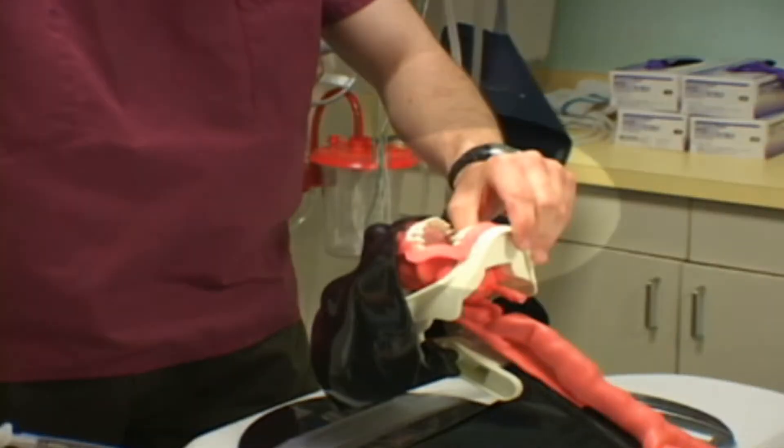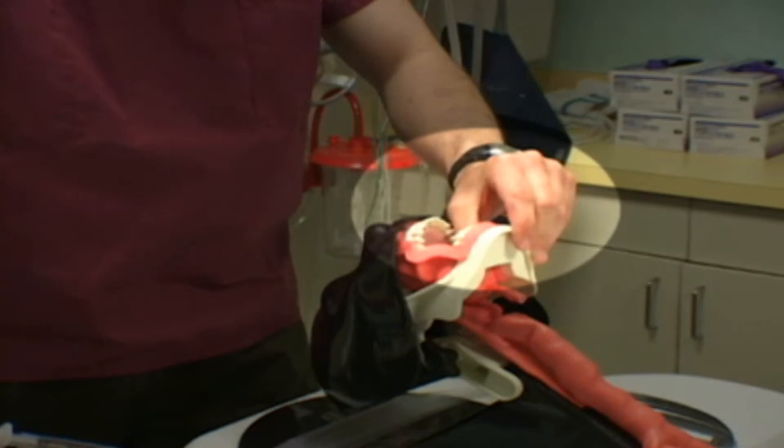The left hand is used to distract the jaw and tongue upward. Alternatively, an assistant can provide jaw lift.